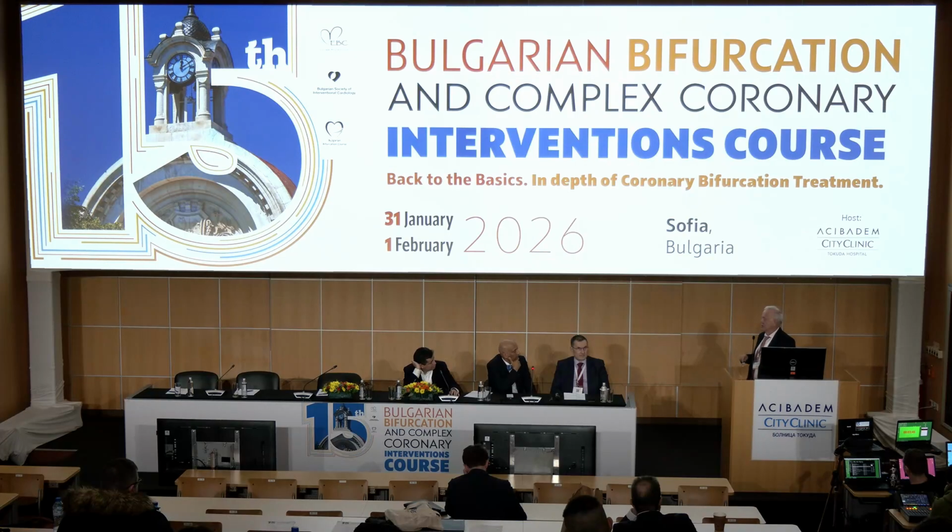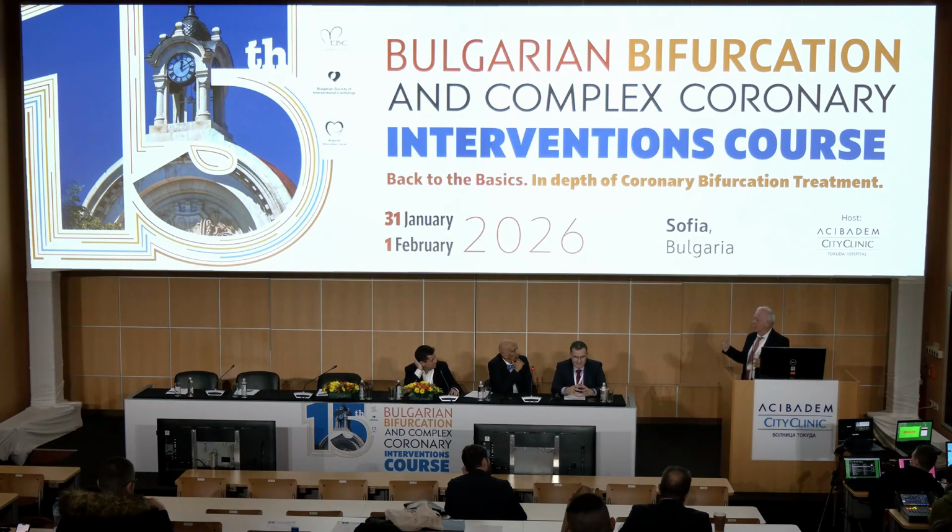But another solution is coming in our group. We interventional cardiologists are the owners of the CT scans. With a CT scan, it's 3-dimensional, so you don't have the problem of sizing. Of course, the patient has to receive nitrate, and we will probably also have to compare that with systematic OCT.